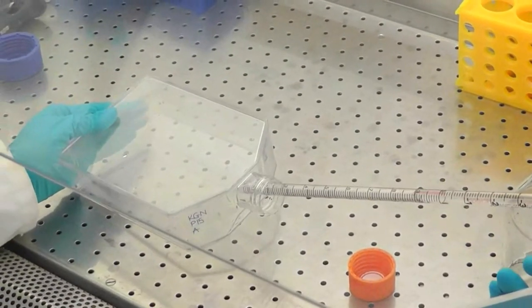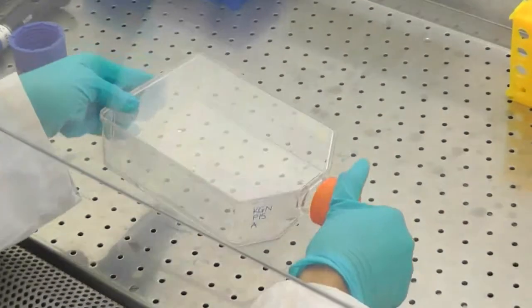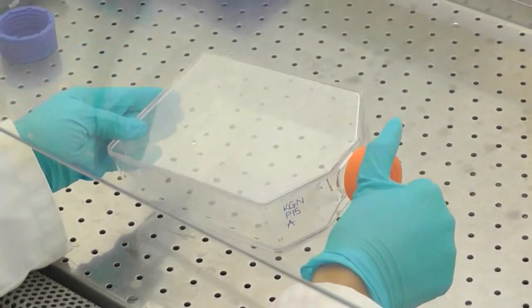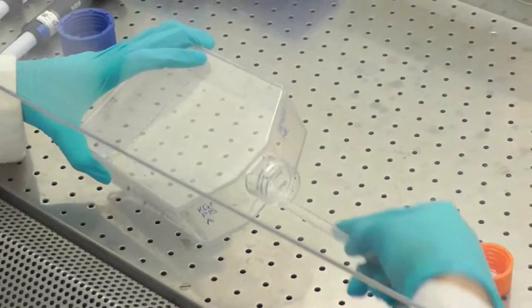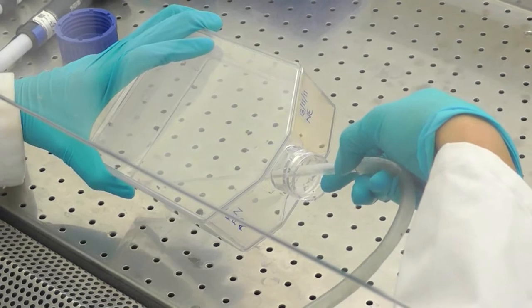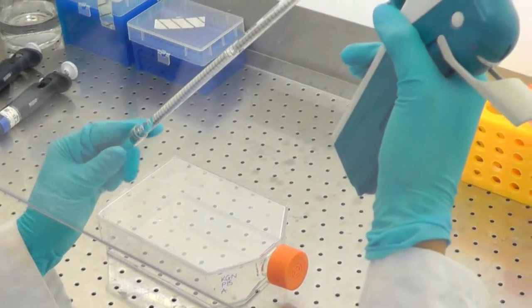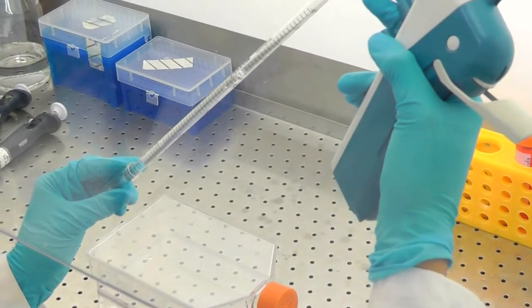To ensure full coverage of the cells with PBS, the flask is swirled around to ensure all cells are washed. The PBS is then aspirated out. The PBS wash step is required as residual serum can inhibit enzymatic disaggregation of the cells. Once the cells have been washed with PBS, they can be dissociated from the flask.